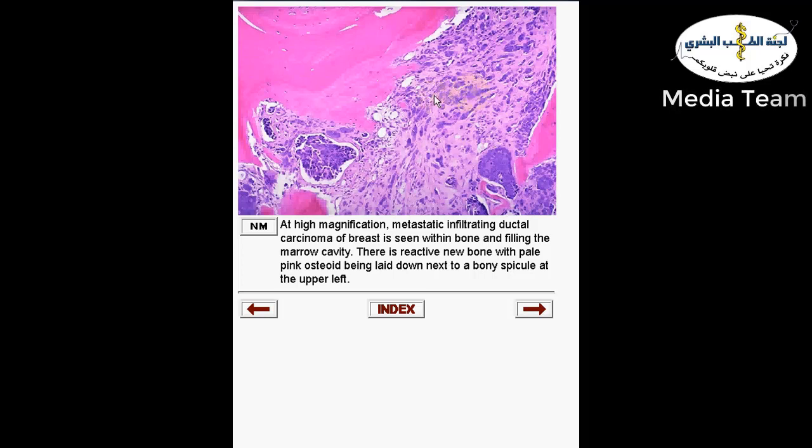Okay. So here we have nests of epithelioid cells. We have a lot of epithelial cells. They are not spindled like sarcoma tumor cells, and they are not depositing osteoid or cartilage. So that's why you have to think of an epithelial tumor. Sometimes if it's metastasis from the colon, or a mucinous tumor of the lung, you can see mucin, with glands producing it just like in the lung or the colon.